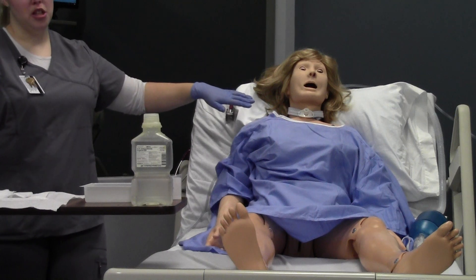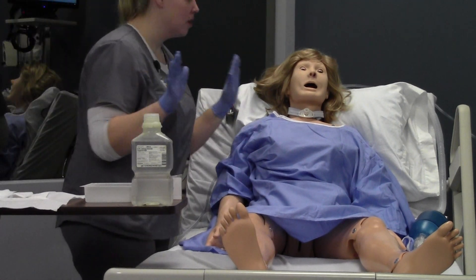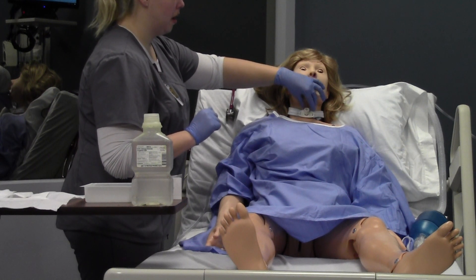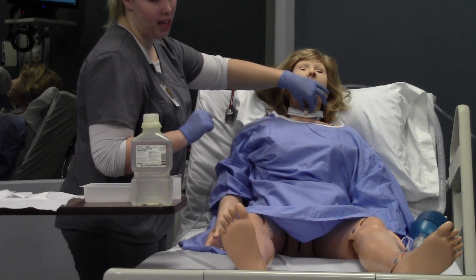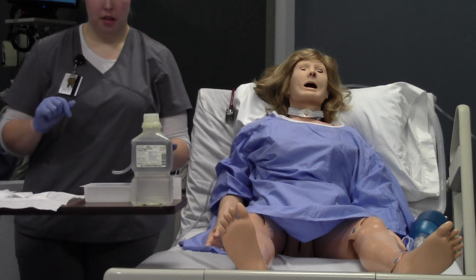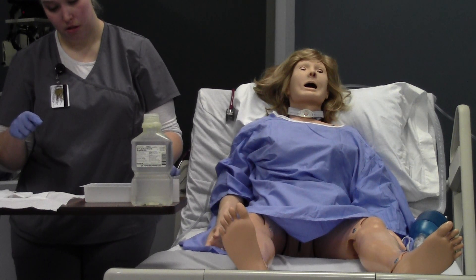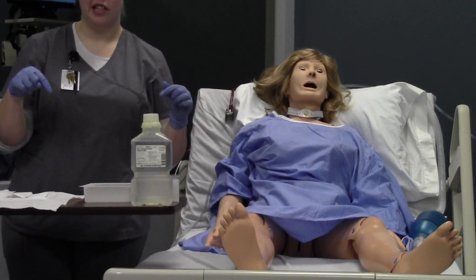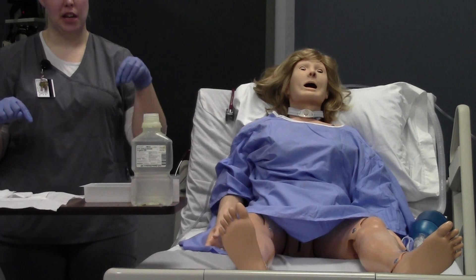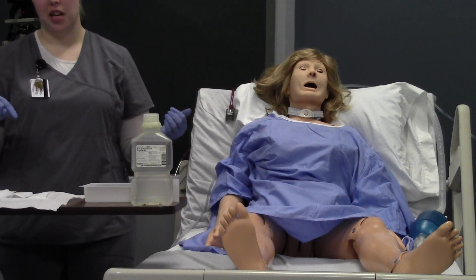We've suctioned your patient. Sats are still stable. Patient is still doing okay. This hand is still sterile and this hand is still not sterile. With my non-sterile hand, I'm going to unlock my inner cannula — use the little loop as you have in the lab — to take out the inner cannula. I'm going to rest it onto the side of my container. The outside of your inner cannula is not sterile, so it's okay to put it on the outside one-inch border so that the sterile part stays sterile and the dirty part stays on the outside of the container.